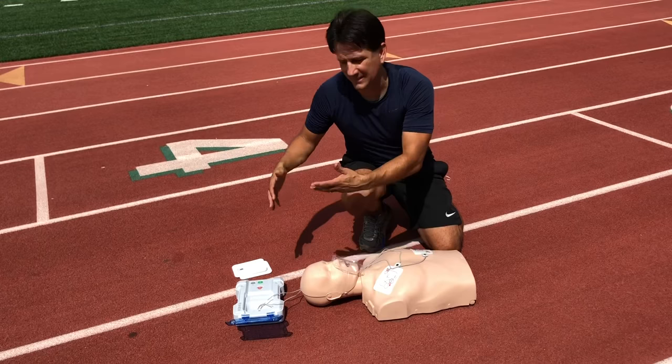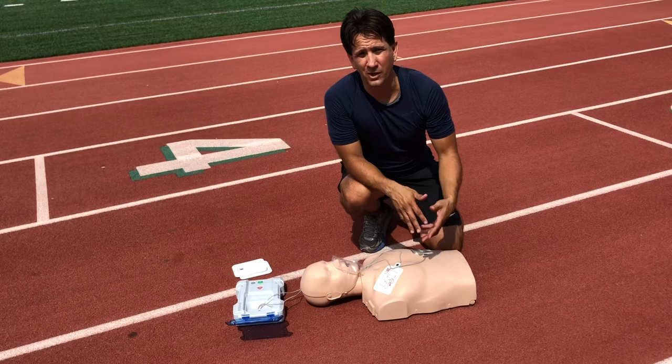That completes the demonstration of how to perform CPR on an adult with assistance from an AED.